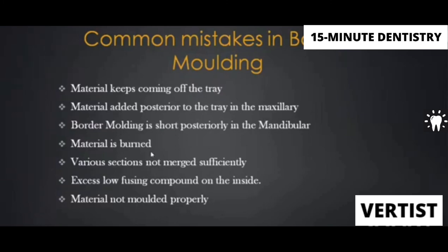The material is burnt. Again, keep on moving the green stick. Various sections are not merged sufficiently.